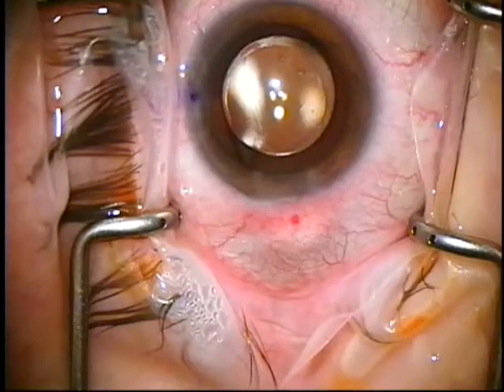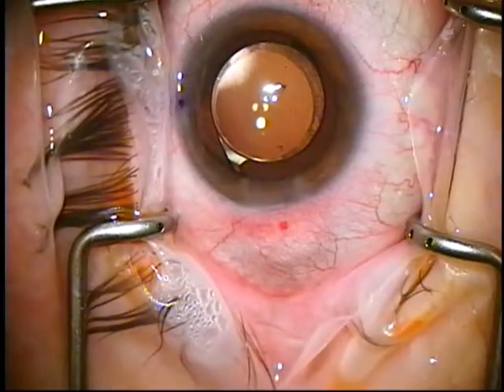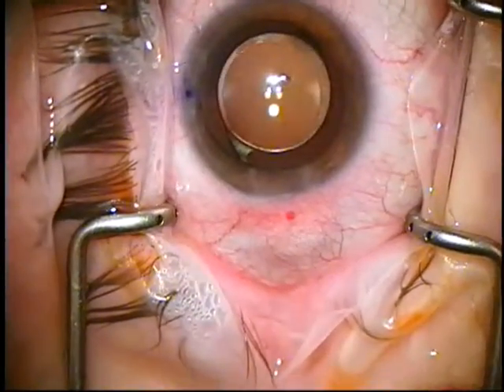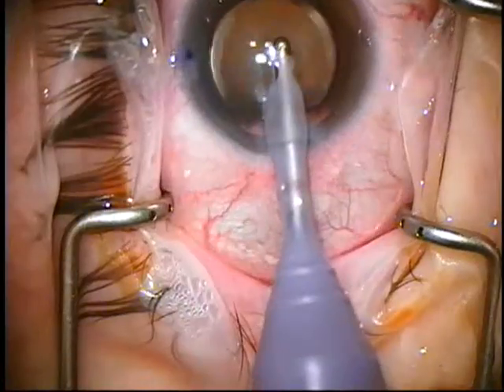If you were doing a premium IOL, you'd want to capture. You don't want a 6 millimeter rhexis. Now, same IA — I'm going to take the viscoelastic out to prevent any pressure spikes.